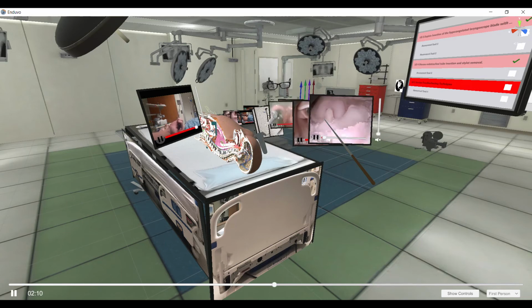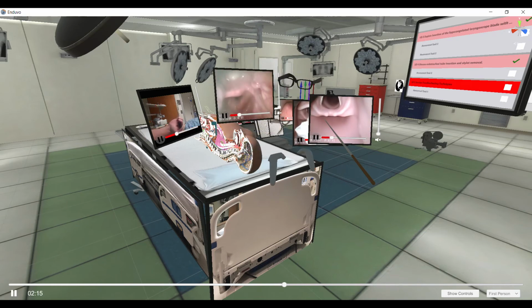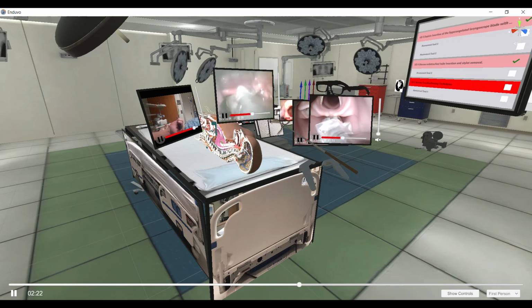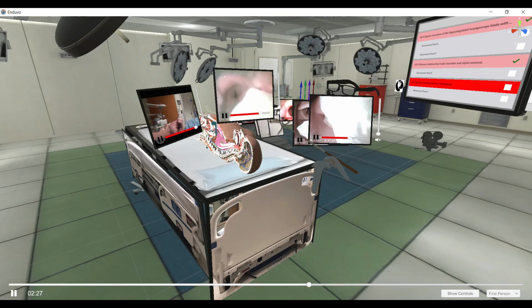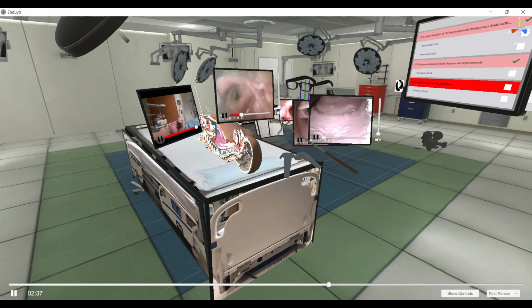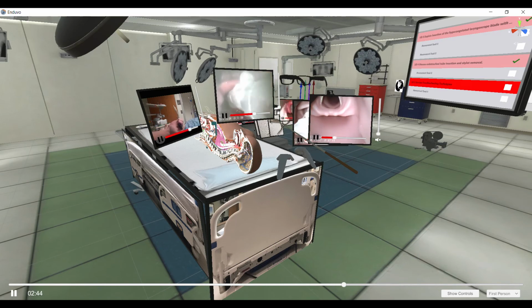All right. So now for a couple of real life examples. So in this first example here, in my opinion, they're too close to the airway itself, and they would have made things a lot easier on themselves by simply backing out a slight amount. And you'll see that they bounce off of the arytenoids a couple of times and are deflected posteriorly before they are able to successfully pass the endotracheal tube. So take a second and watch that video and think about the things that you could do from a troubleshooting standpoint to make intubation easier.